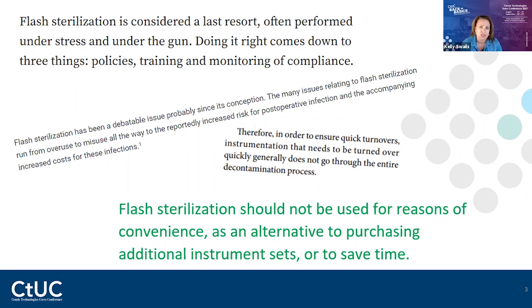But one thing about this is, did you know that Joint Commission has put forth critical steps for IUSS, so that if a device is processed by IUSS and then used on a patient, you have to be able to trace that information to the patient? The critical steps required are cleaning and decontamination, so you have to show that it was cleaned and decontaminated and document that, and sterilization documentation, and transferring the IUSS items, which I'm wondering, now that everything is so closed, is that really an issue? Maybe they'll get away from that one.